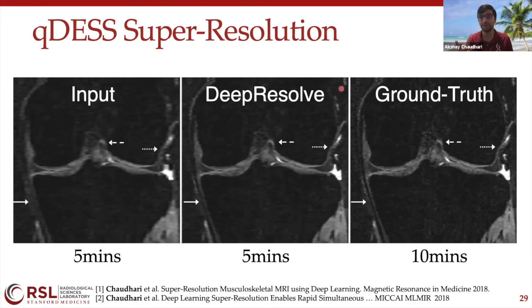And we saw that there's a 98% overlap in the cartilage surfaces with this deep resolve enhancement method. And that's a really high accuracy in terms of how the tissue is actually segmented. In addition to that, we also had 2 radiologists count some very subtle features called osteophytes. And I think those are generally evident here.